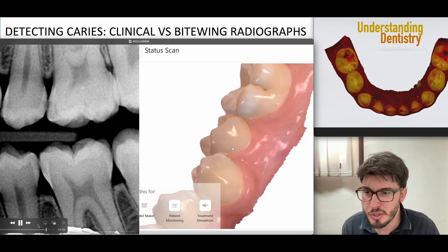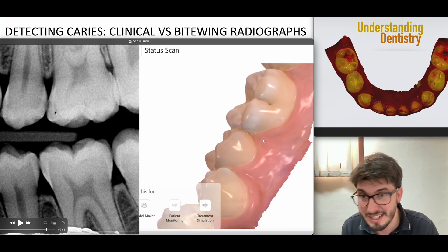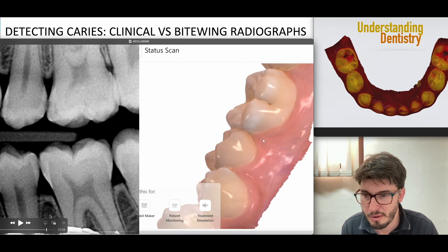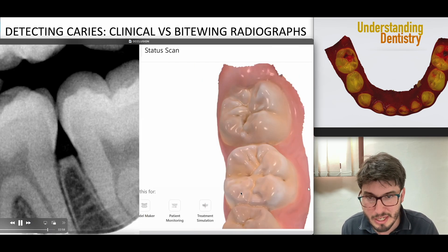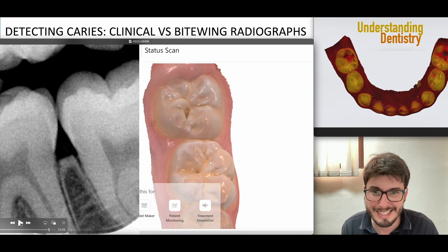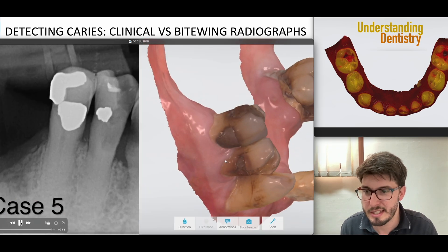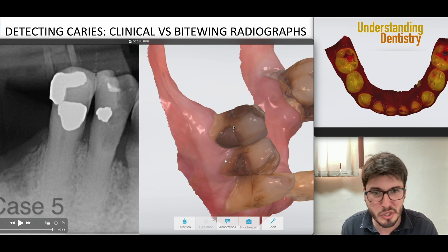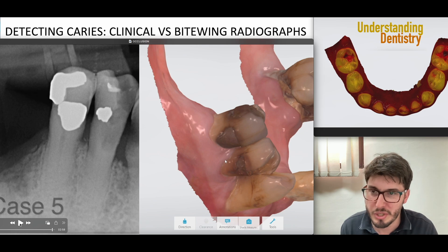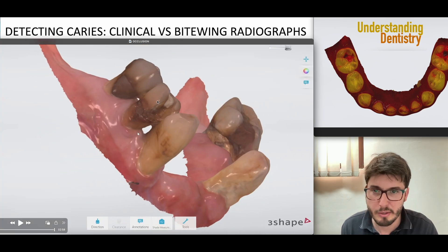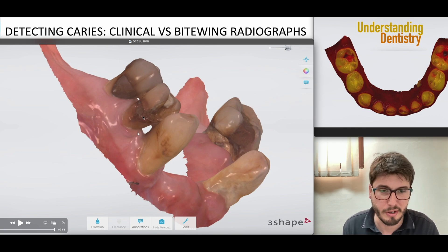These are initial lesions almost affecting the dentin — actually this is affecting the dentin. In the upper teeth and lower teeth we also have interproximal alterations. Zooming in, we could monitor this situation. In this last case, you're seeing a premolar with two metallic restorations — a buccal and an occlusal-distal restoration — along with distal horizontal bone loss, and the adjacent first premolar is cavitated.